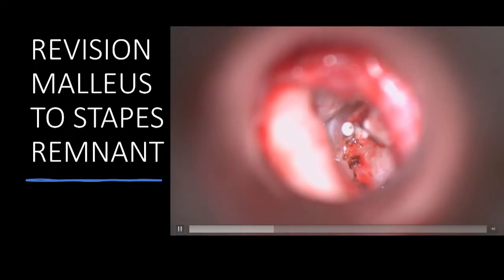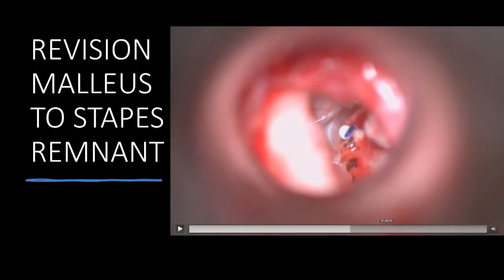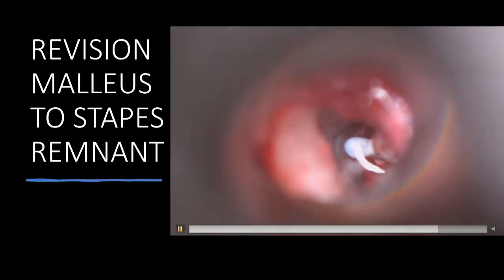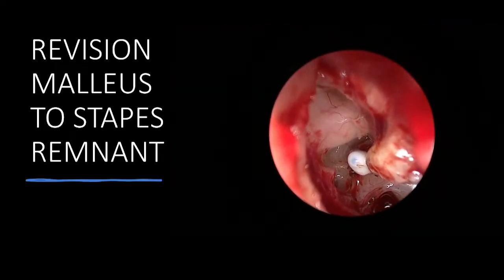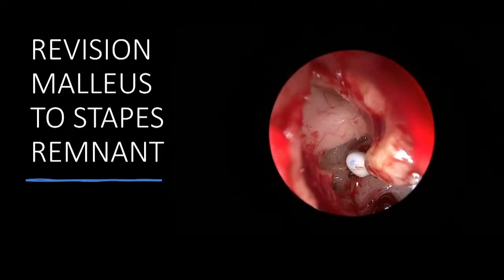We then rest this. Now, please, we're not saying this should be for every case. This is just something different to be controversial, all right? And then on top of that, for sake of time, I'm just going to move a little bit forward. We put our little new nylon. We continue to envelop it with the Ketac-Cem, and that was our final look. And the good news is, this is about 4.5 years out, and this patient is still fine.